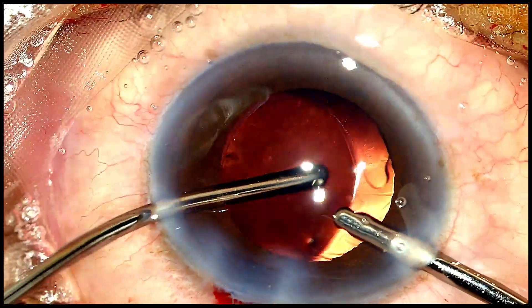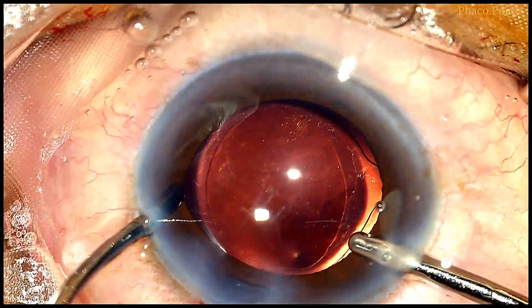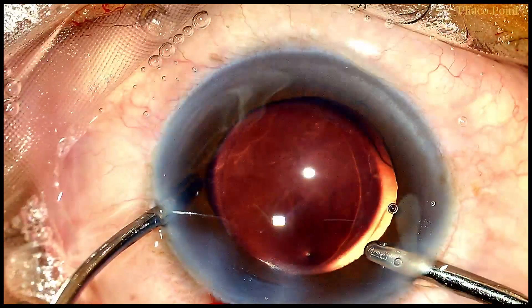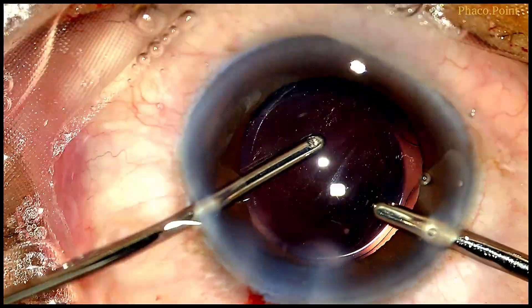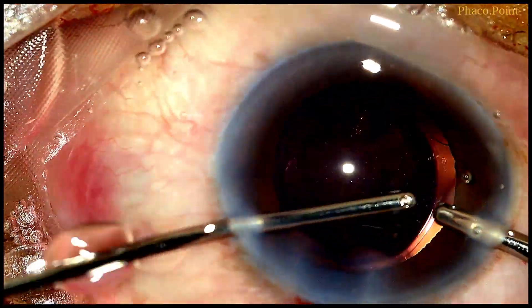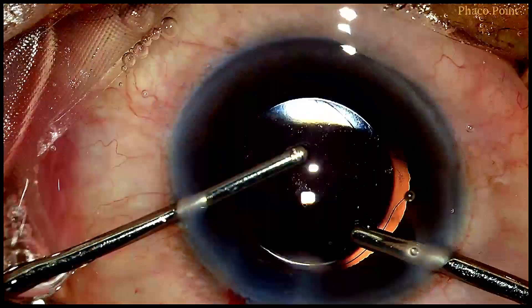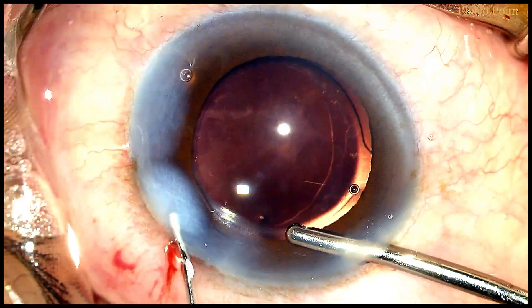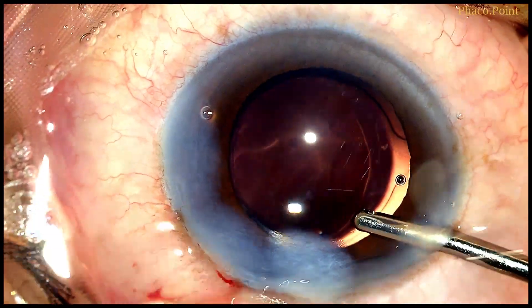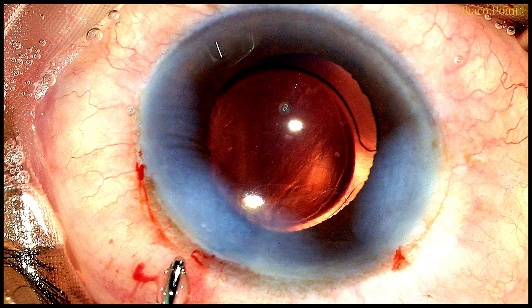Also note that even though we have created an oval rhexis, the vertical diameter covers the optic edge both superiorly and inferiorly. For all the reasons demonstrated in this patient with a polar cataract, I believe an oval rhexis will definitely aid the ease of operating and significantly reduce pressure on the posterior capsule, thereby reducing the chances of an intraoperative PCR. Following removal of excess viscoelastic, the wounds are hydrated, bringing us to the end of this surgery. I hope you found this video tutorial useful. Thank you.